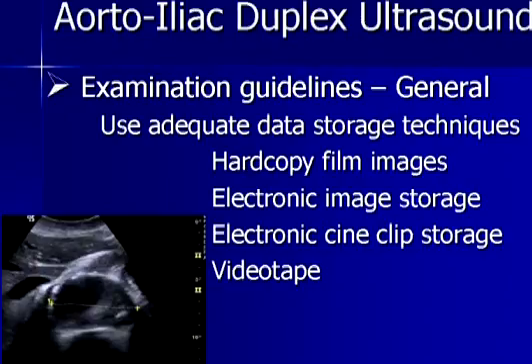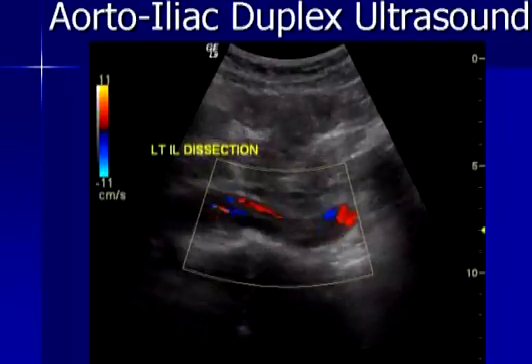Certainly you want good data storage techniques. Most hospital-based systems are now in some type of PACS system. It's not an issue. If you're in a smaller office setting, you want to make sure you have good quality storage, not only of your still frames, but there are certain instances where electronic video clips you will want to store with good resolution as well.